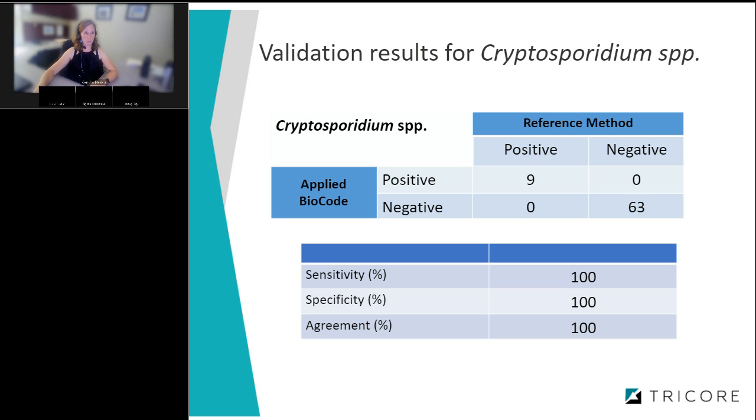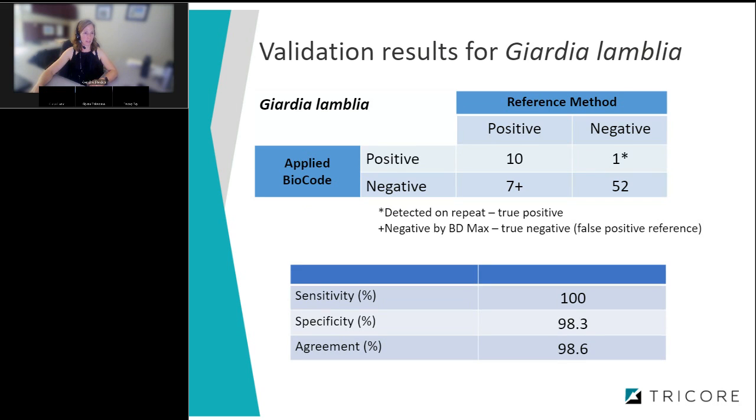So here are some of our results. Our validation results for Cryptosporidium looked really good. We found 100% agreement between the two methods. Our positives were all positive by both methods, and the negatives were negative by both methods. So we found that really promising.